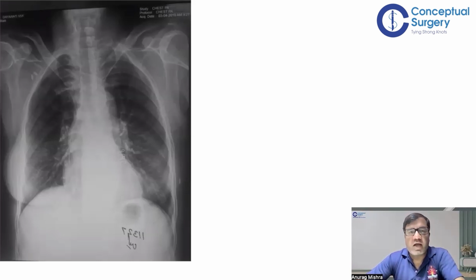So it will always start with the identifiers, like who is this person, who is this patient, do we have any relevant history available with us or not? And then in a methodological order, we'll provide the findings of it. You'll always do well if you have some system in narrating the findings, okay? Like in a case presentation, we first say that this is such and such person, this is the age, this is where the patient is from, these are the presenting complaints and all that.